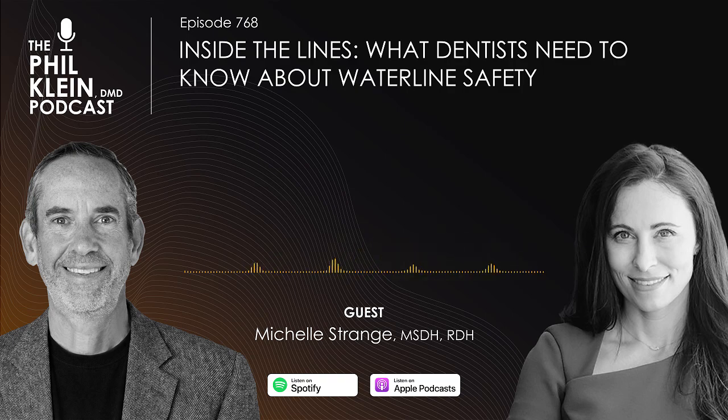They're low flow. These lines and nooks and crannies and everything within the unit itself are a perfect breeding ground. If you ever question, I want you to think about your periodontal patient that has all the nooks and crannies. And if they are not coming in for their periodontal maintenance, which I call the shock of the system, think of how dirty and contaminated that is with biofilm. And that's what we're dealing with in these tiny, low flow, plastic little tubings all throughout our lines.